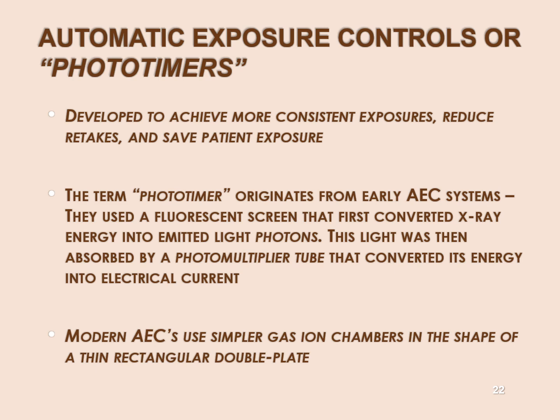This was the technology of the 1940s and 50s. This is what we had. The photomultiplier tube would change the light into electrons and then amplify those electrons and make it into an electric current. But it always required over-penetration of the image receptor.